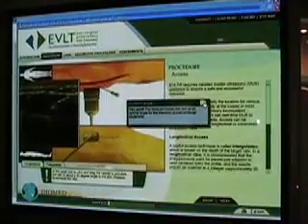There's a variety of interactive animations like that for tumescent anesthesia, for access, for pullback rates and assuring procedural efficacy. There are animations of our procedures, as well as significant diagnostic ultrasound and anatomy simulations that really help educate. Generally, they'll have what we call symptomatic venous disease. The most common form is varicose veins, but it has other symptoms, and what generally underlies it is a disease condition called venous reflux, or superficial venous insufficiency.